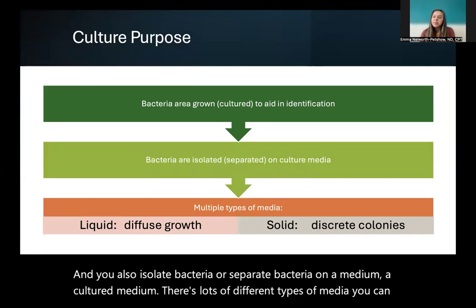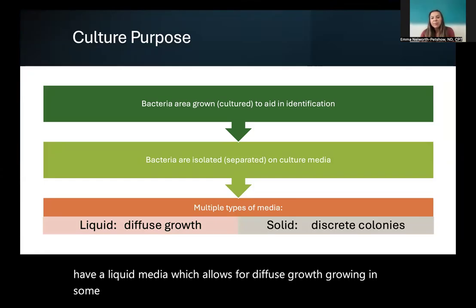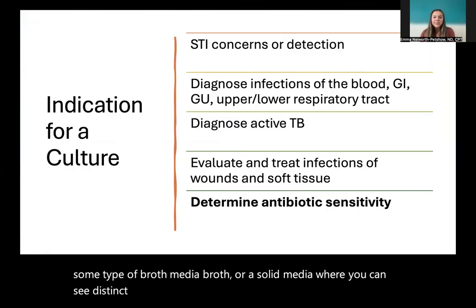You can have a liquid media, which allows for diffuse growth, growing in some type of broth, media broth, or a solid media where you can see distinct colonies.